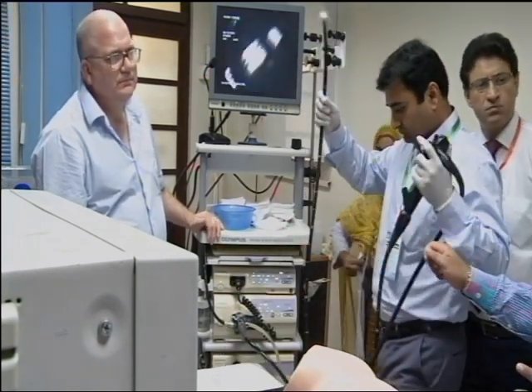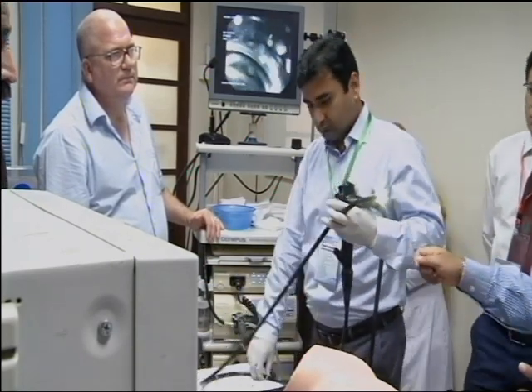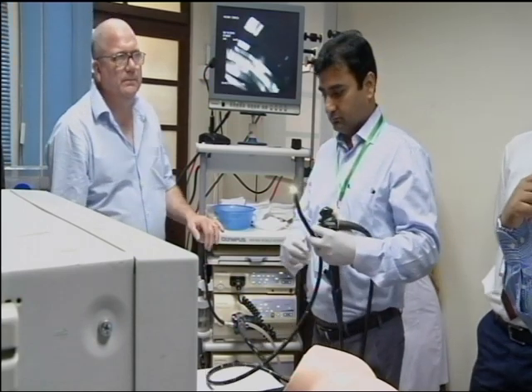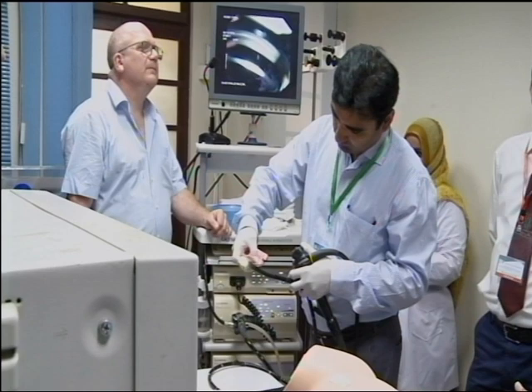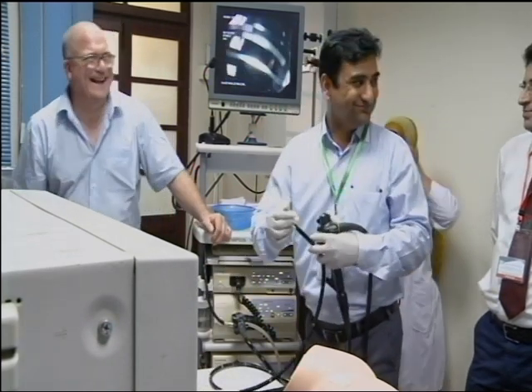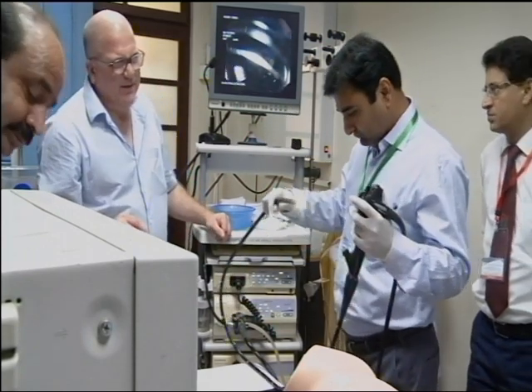Relaxing the scope mainly. How you will keep the lumen centred by relaxing the scope and the position of my body. My right hand, my left arm, and everything. My initial learning points were to check the equipment. So, what are all your learning points?